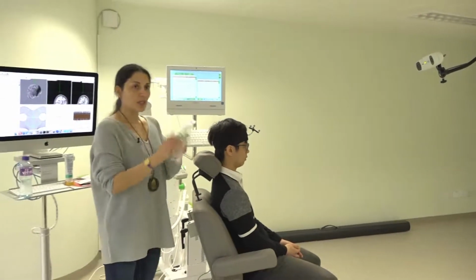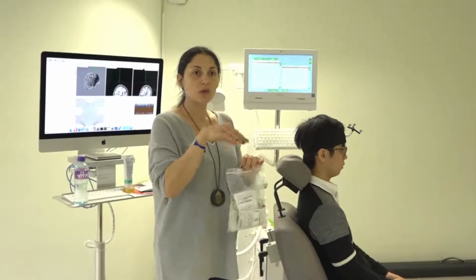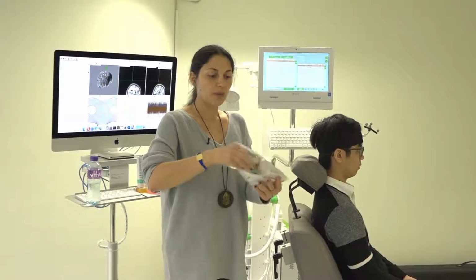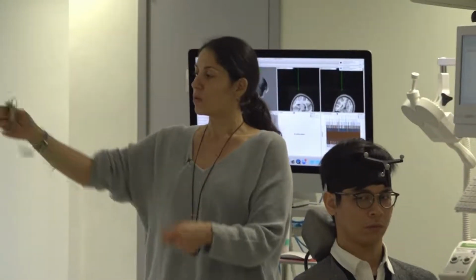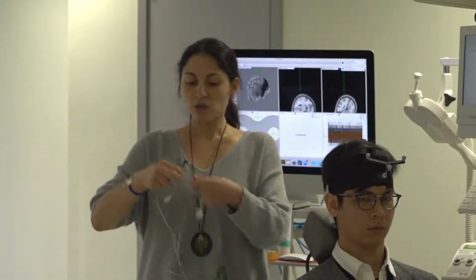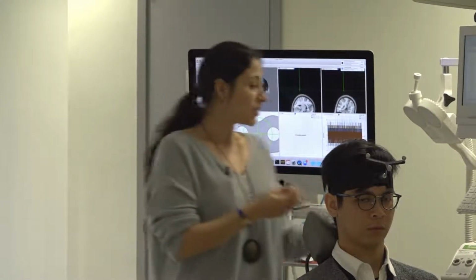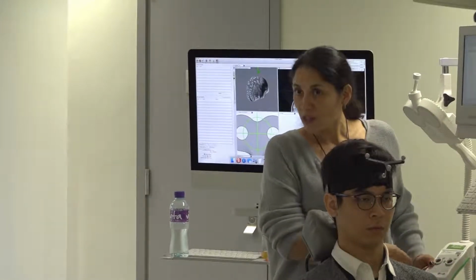You have your kit here. As these are cabled, you want to remove them each time and store them. Normally, you don't leave the electrodes there flying. So what we are going to do is connect this here. We are working with channel 1. You have 2 channels here, so pay attention to it.